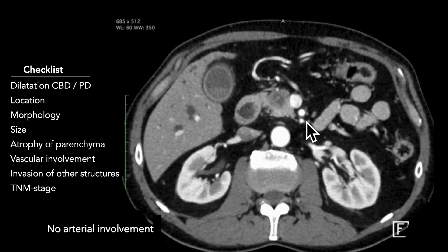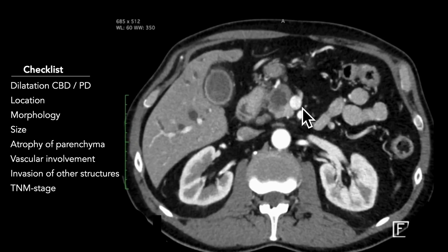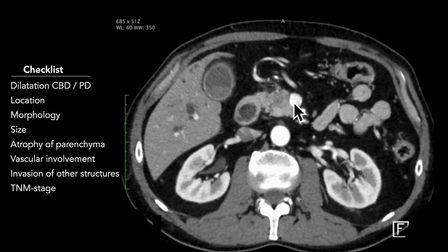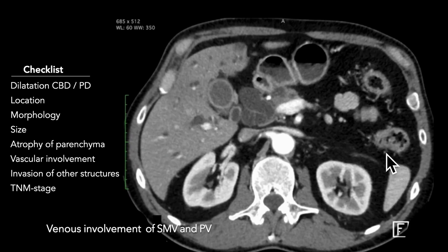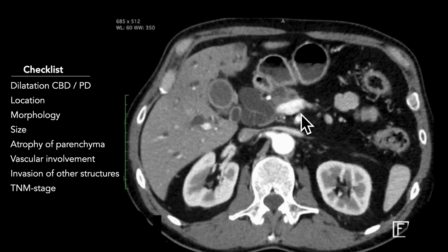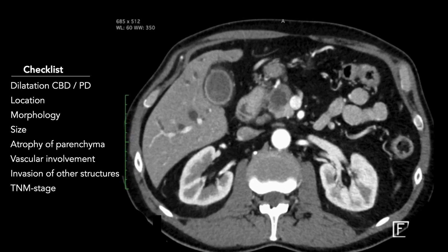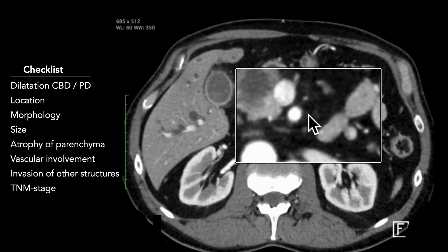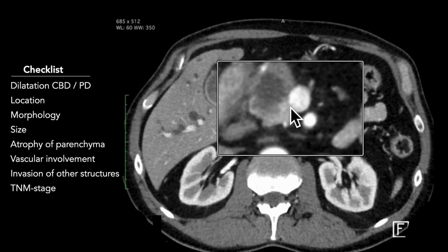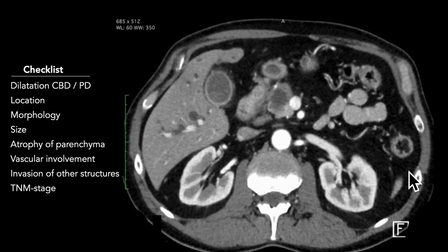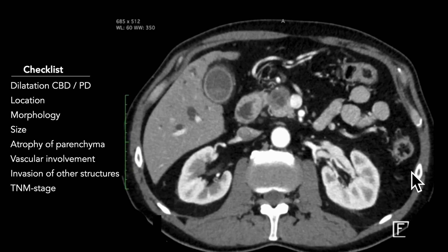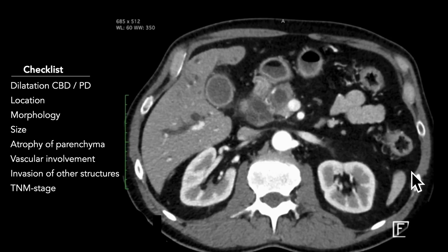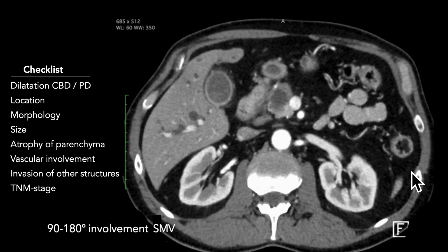In this case, there is a relation to relevant venous structures — both the superior mesenteric vein and the portal vein. Looking at the degree of involvement, there is just over 90 degrees of involvement of the superior mesenteric vein. One may want to look in other directions or create a curved MPR to confirm this involvement — just over 90 degrees but less than 180 degrees.